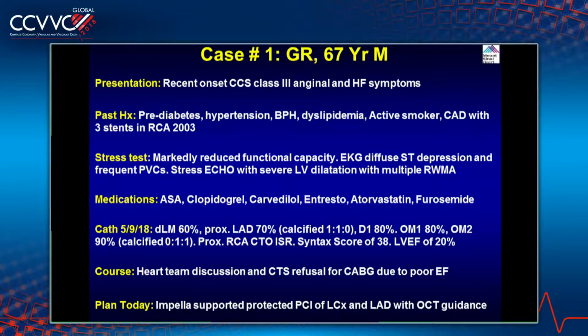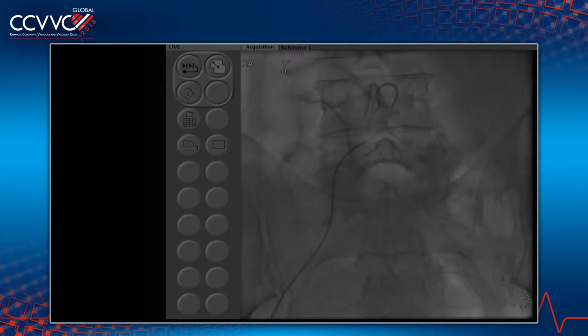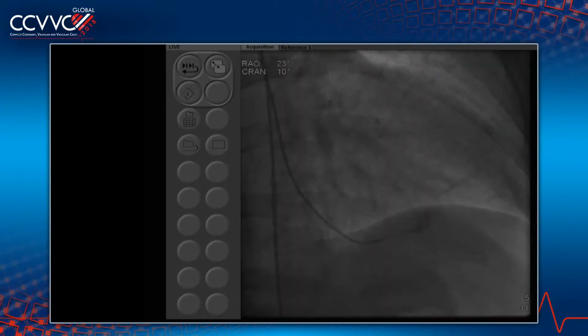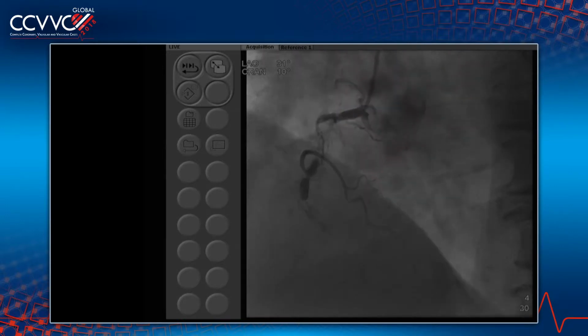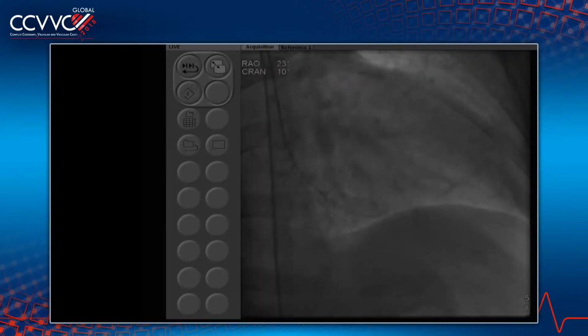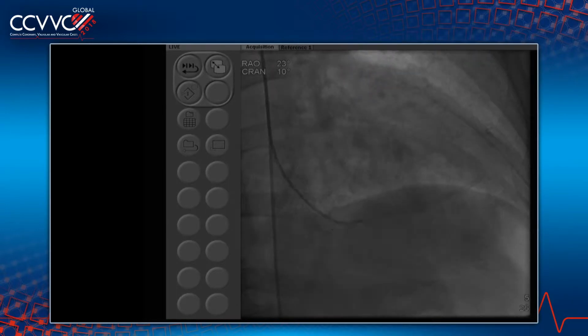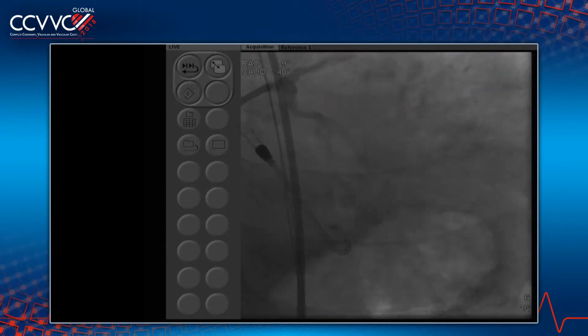So this is where we are with his angiogram. I'll show you the angiogram first. The right coronary artery. LV first. Totally occluded. Severe LV, pretty bad LV. So he has an EDP of 36 today, despite being on medication. And this is where we are.